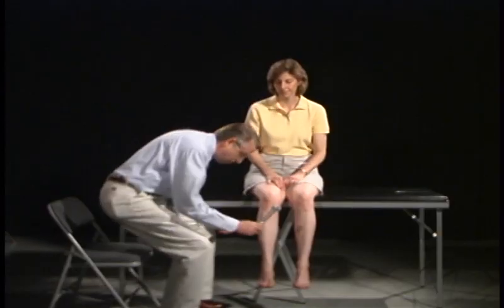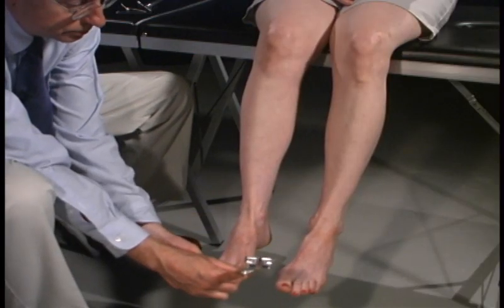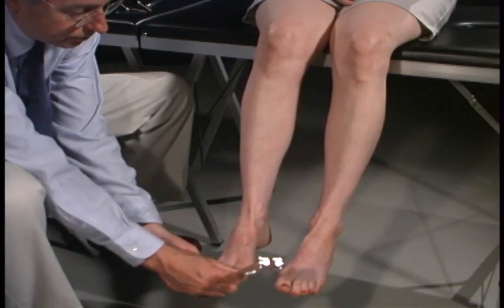We're going to do the same thing down on your ankle. Can you feel that buzz? Yes. Okay. Can you feel it buzz here? Yes. How about now? No. How about now? Yes. Good.